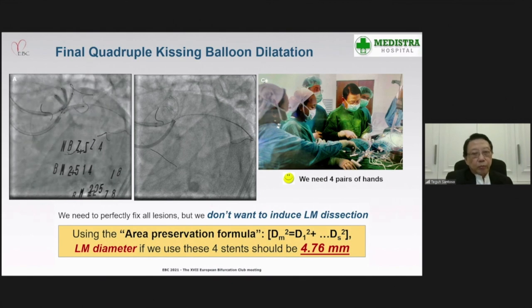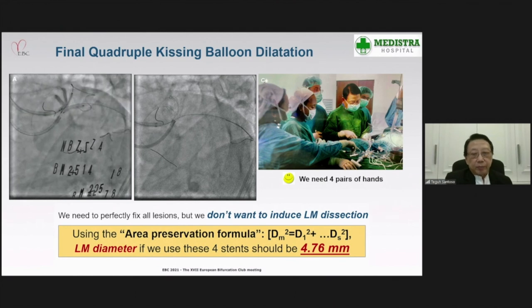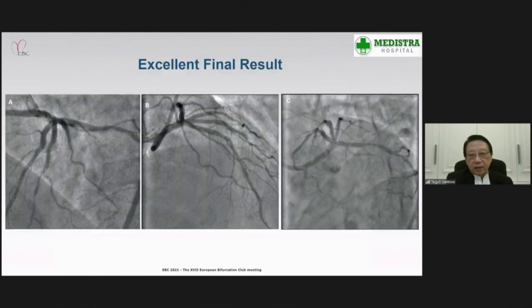So to perfectly fit all lesions, of course, we don't want to induce left main dissection. So we used the area preservation formula like this, and we came up with a left main diameter of 4.76 millimeter if we want to use four stents as we use in this patient. So of course, we need four pairs of hands to do the procedure, and this is the situation in the cath lab at that time. So we obtained an excellent result shown here.